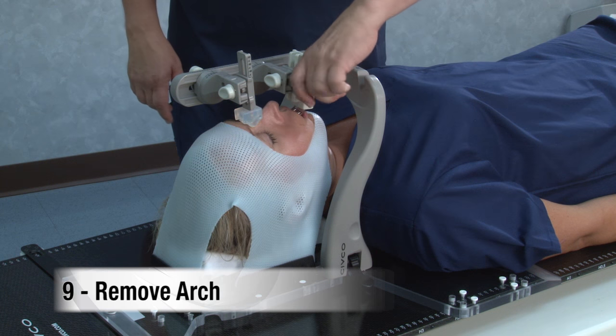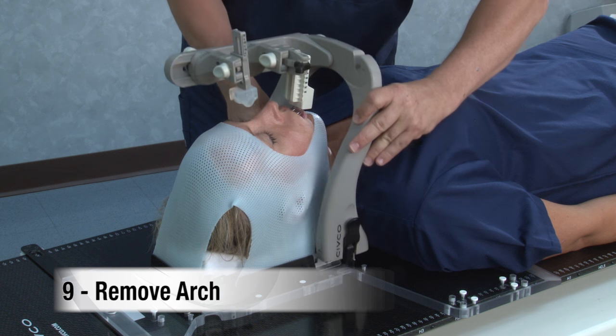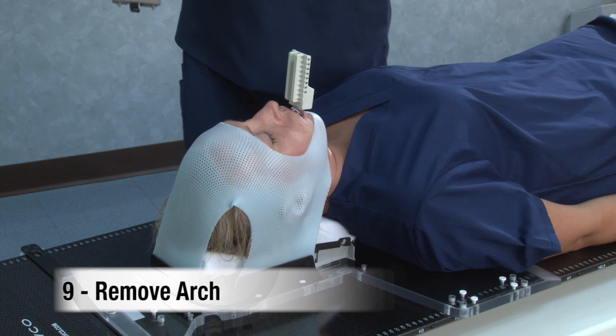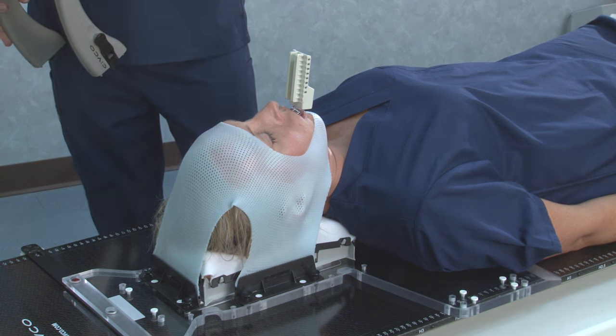To remove, open the lever on the bite cup and unlock the arch from the base plate. Carefully lift the frame upward. This same simple removal process allows for quick release in an emergency situation.